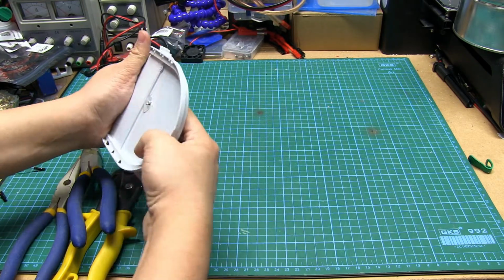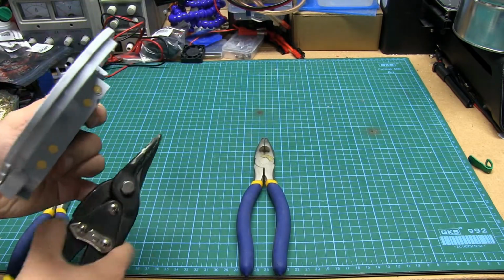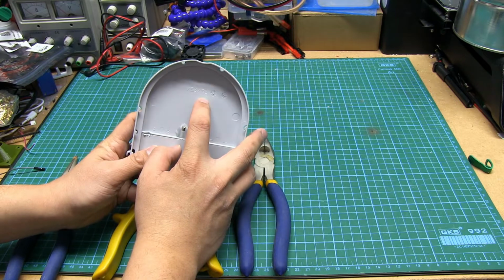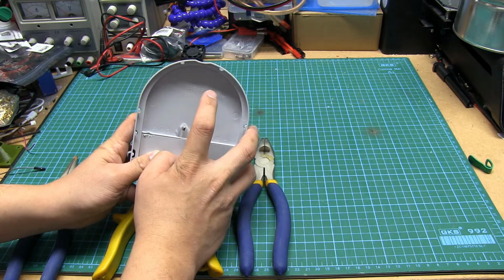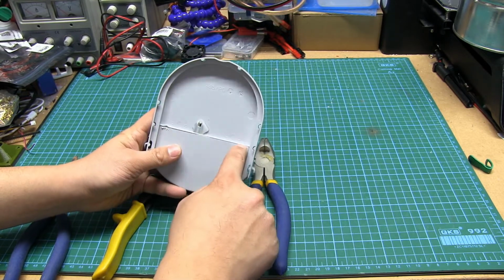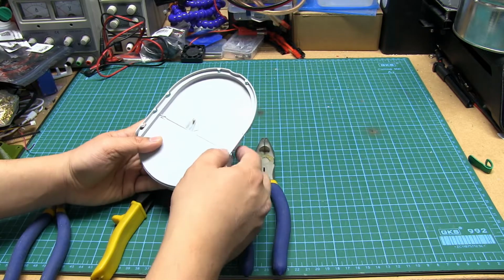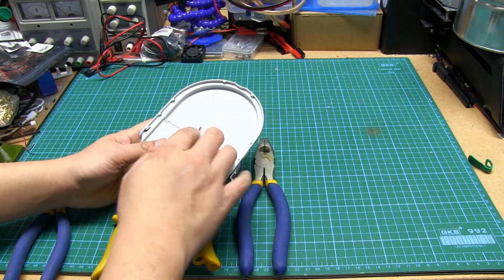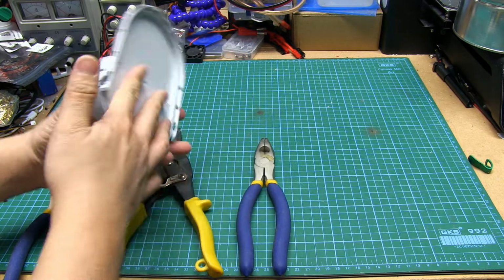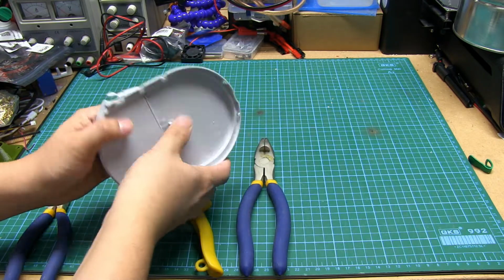Alright, on the pack itself we've got, I guess this portion here is all superfluous and non-battery related, so we can probably just start cutting into that just to give us more access. Now, another item of note, okay, here it's on camera, ABS polycarbonate. That means it's a durable plastic. I've already had a go at trying to get into here. This is likely solvent or ultrasonically welded. It's not snap fit construction, or if it is, it's snap fit with glue underneath it, so it's very hard to get into here. But that also means that the plastic does have a good springiness to it, a good impact resistance. It's good material. It's not glass fiber reinforced, but that's fine because the pad pack itself shouldn't take very much abuse.